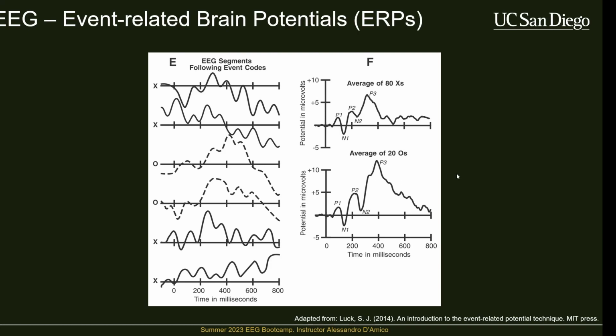And I don't know if I had this on a slide, but I wanted to say right off the bat, because it's confusing at first glance, that a component does not mean it is a peak or a trough, right? So I can't just take any arbitrary recording and say, I see this peak right here, okay, this is a negative going peak at around 575 milliseconds.